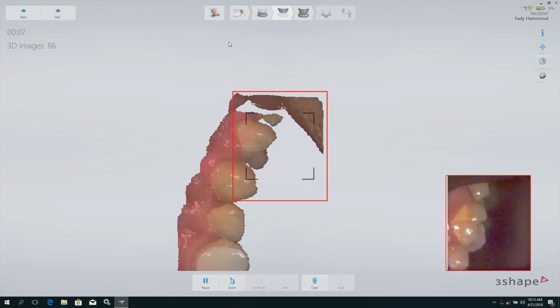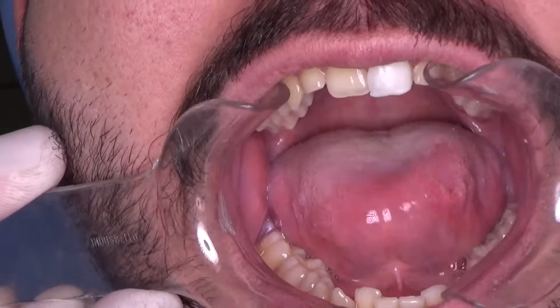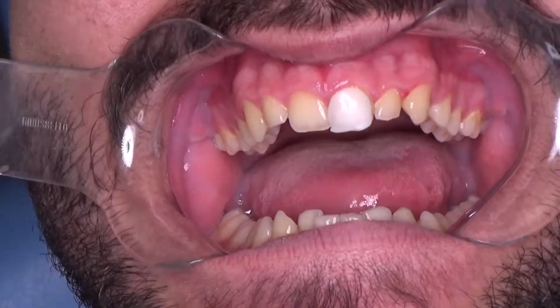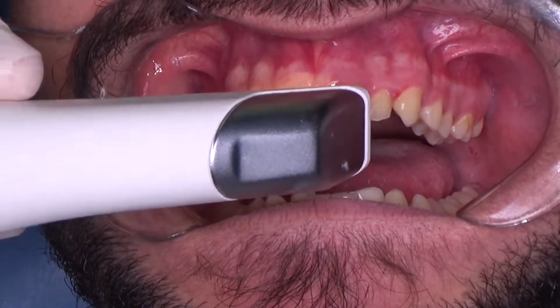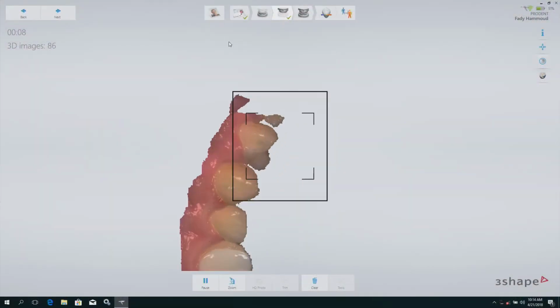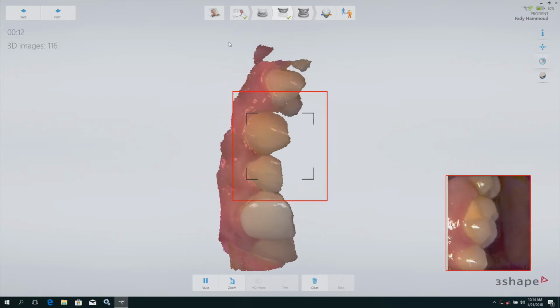Sorry, we have the retractors. With the 3Shape camera, if you're lost, you have to go back to the centrals and then go, okay, now go fast to the end of the jaw.